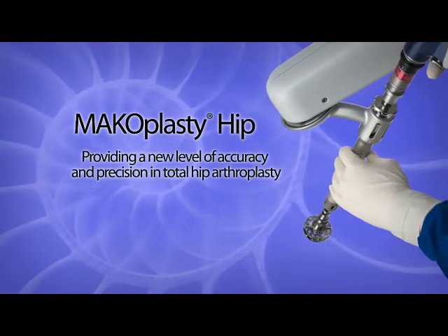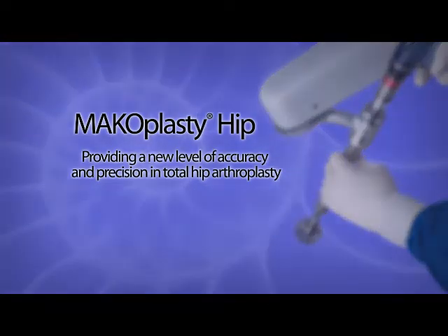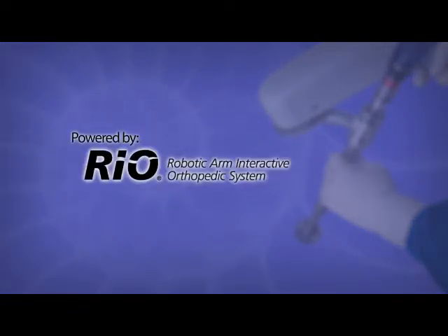Makoplasty Hip, providing a new level of accuracy and precision in total hip arthroplasty with the assistance of innovative robotic arm technology.